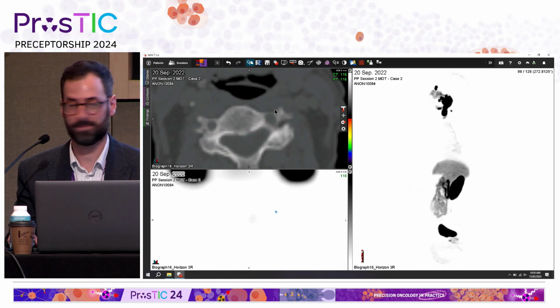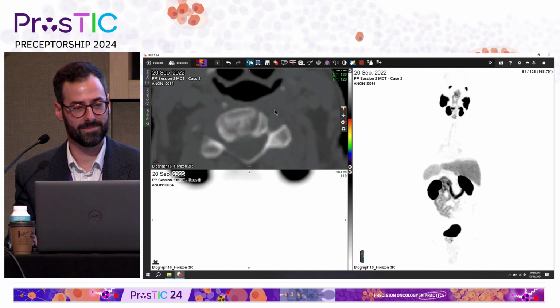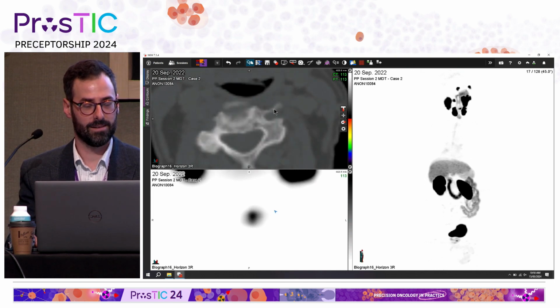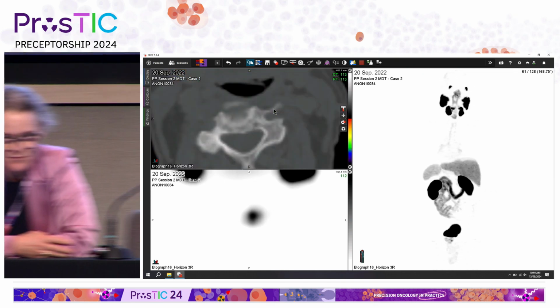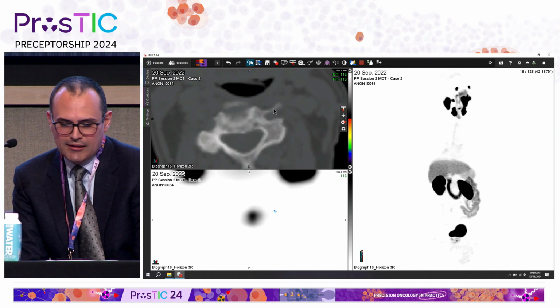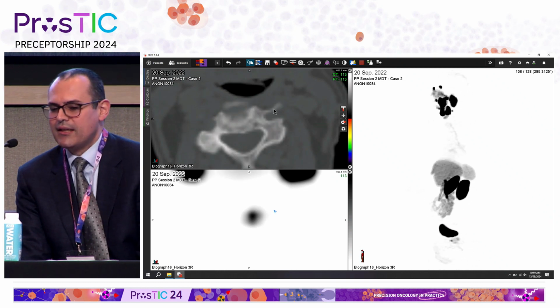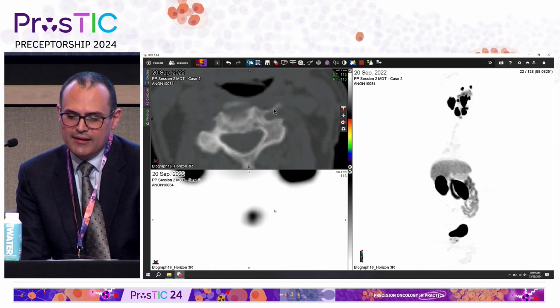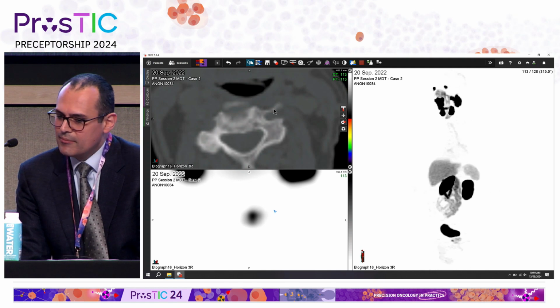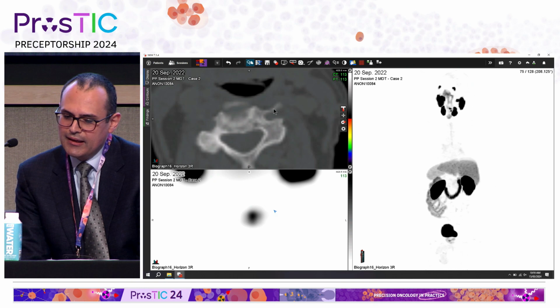What do you think about that, Sidney? Hemangioma. Why do you say that? Because you can see that there is a subtle lesion there, and I would want to know more about. Actually, I think we have the introduction, but it wasn't a particularly high risk cancer. There wasn't anything in the pelvis. There wasn't anything anywhere else, and I can see a lesion on the bone scan that doesn't look on the CT that doesn't look particularly aggressive.